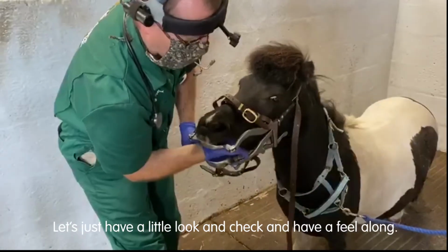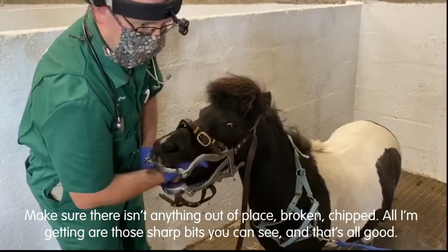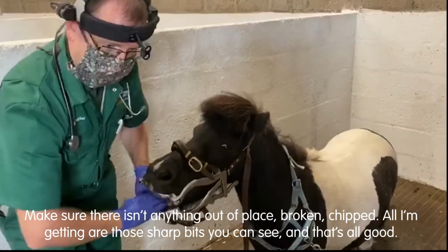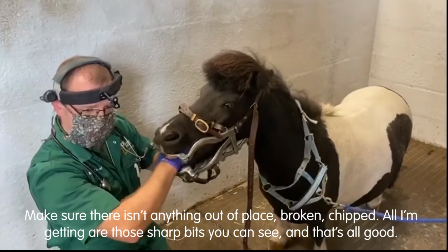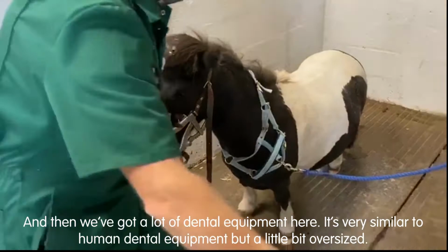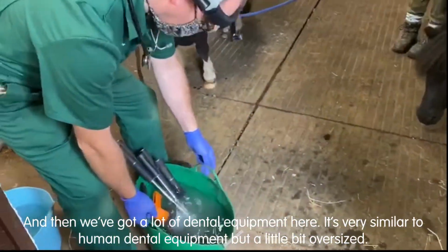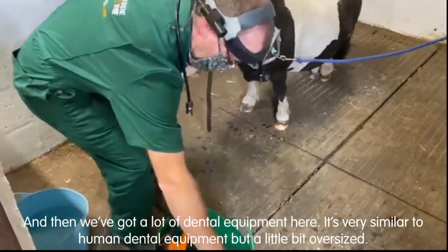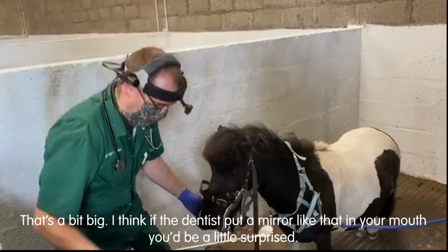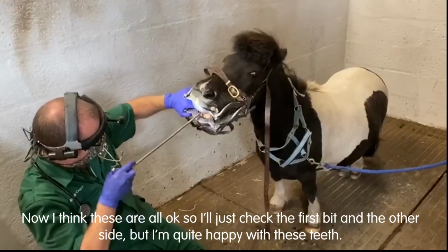and have a little feel along. Make sure that there isn't anything out of place, broken, chipped. All I'm getting is those sharp bits that you can see. So that's all good. And then we've got a lot of dental equipment here, which is very similar to human dental equipment, but a little bit oversized. That's a bit big. I think if the dentist put a mirror like that in your mouth, you'd be a little bit surprised there.